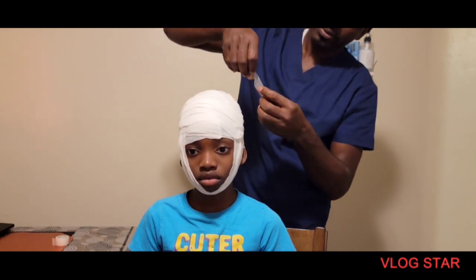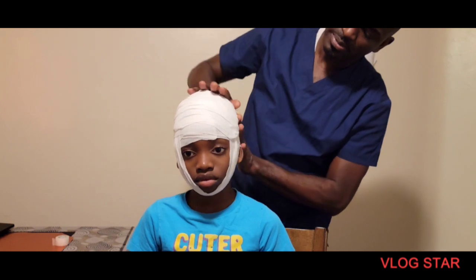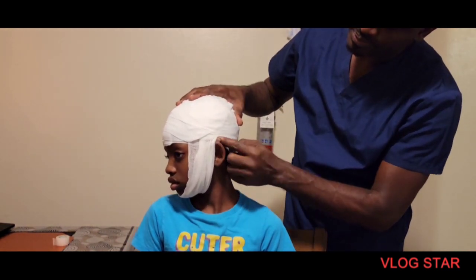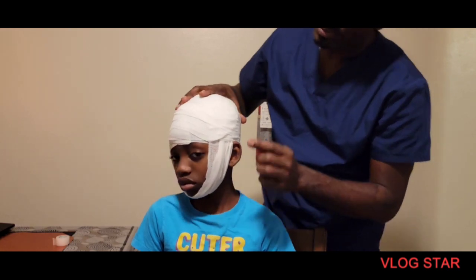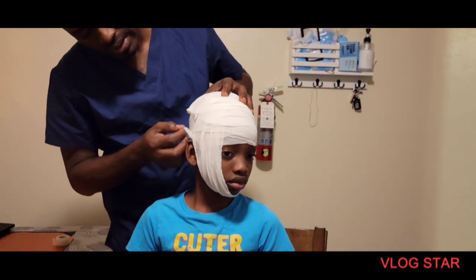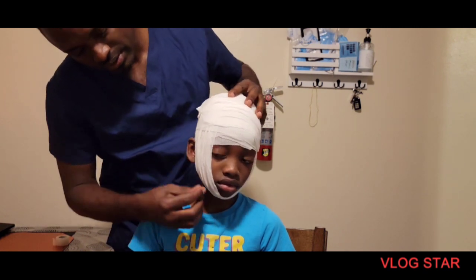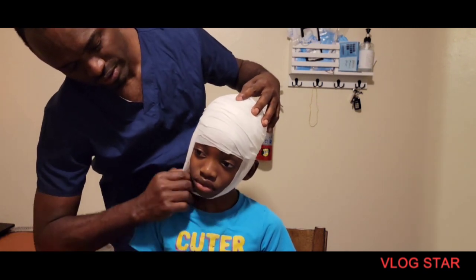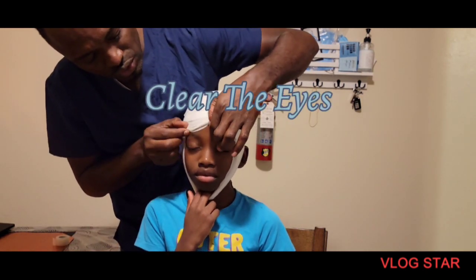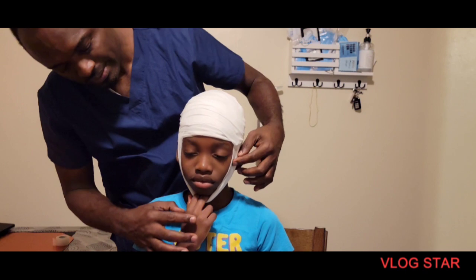I'm going to use the tape to secure and make sure the tape is out. That is good. You can turn to the side for me please. Make sure it's in the space. The person's vision is okay.